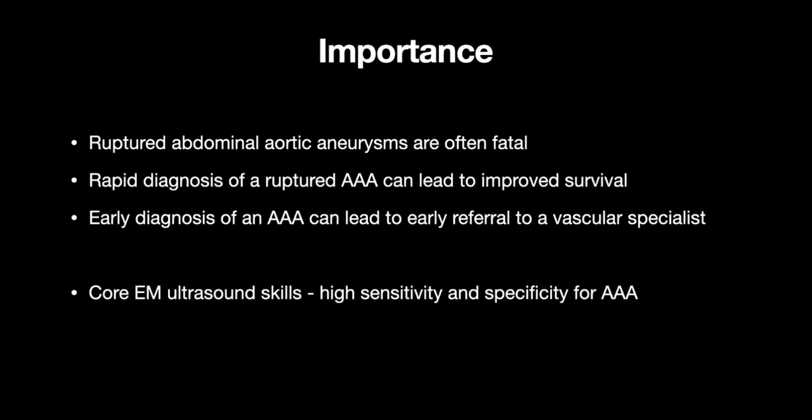What are we going to cover? Well, we'll go very briefly through the importance of ultrasound assessment of the abdominal aorta, a bit about the anatomy, and then the views that are required to assess the aorta, a bit about troubleshooting, and then a brief summary of things.